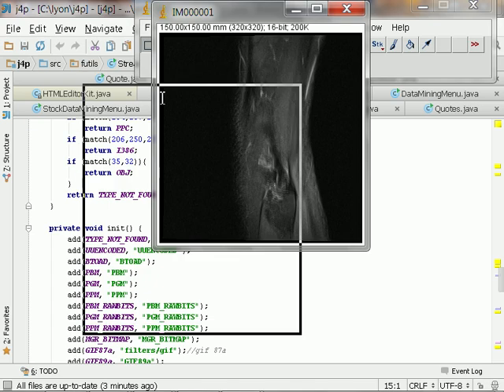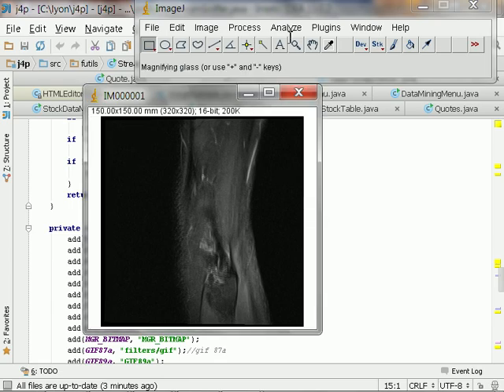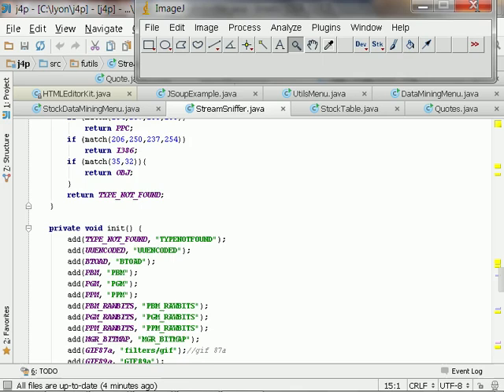It's not a particularly high-resolution image, is it? As a matter of fact, it's 320 by 320 in 16-bit. Possible when they give you the copy, they give it to you as like a low resolution, so you don't go to another doctor and get your own opinions or something like that. Well, in fact, that's exactly why I wanted it. Yeah. I want to do my own opinion.